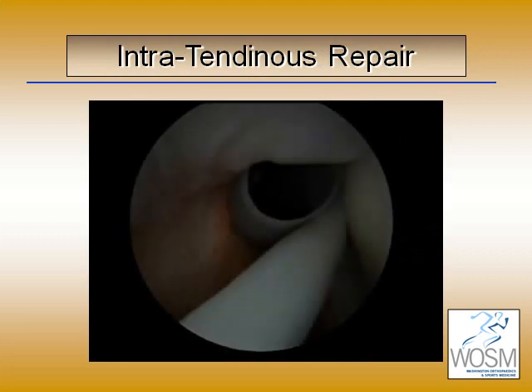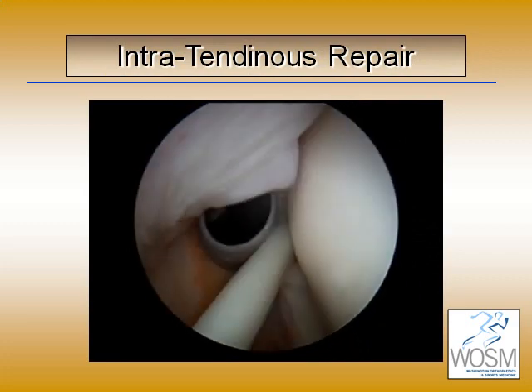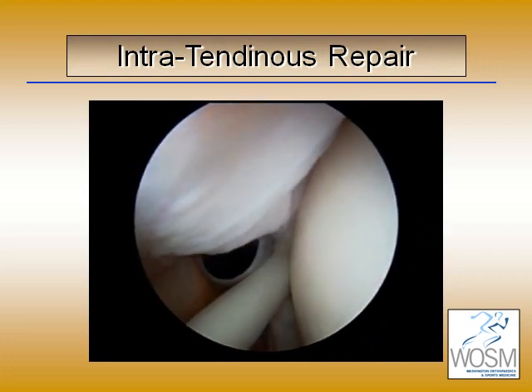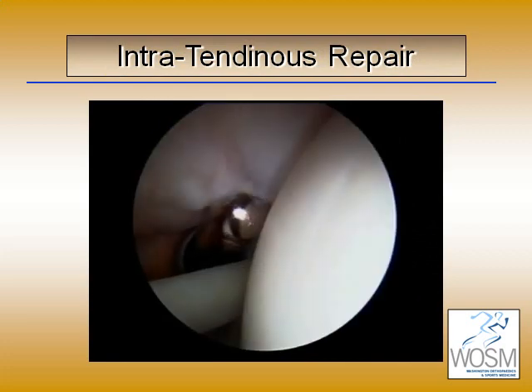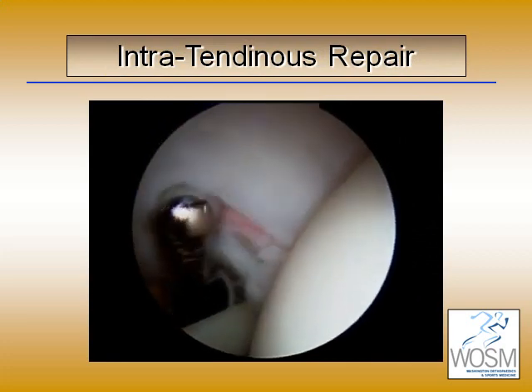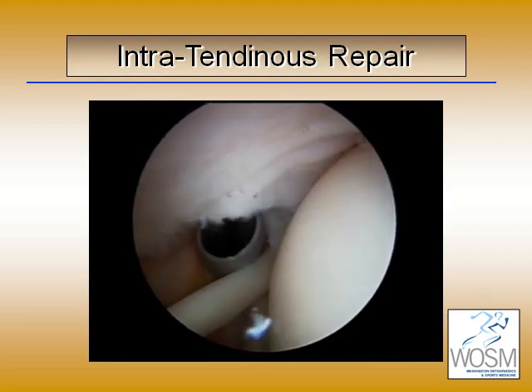This is an example of an intratendinous repair in a 19-year-old baseball pitcher. Notice this cannula in the front. This is footage afforded by John Conway. We pass a probe and confirm the depth of the lesion, which is now debrided on the articular margin with a shaver.